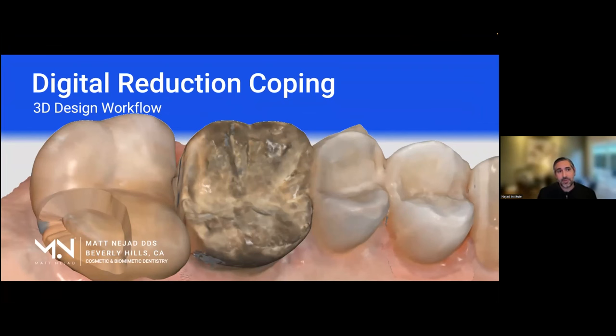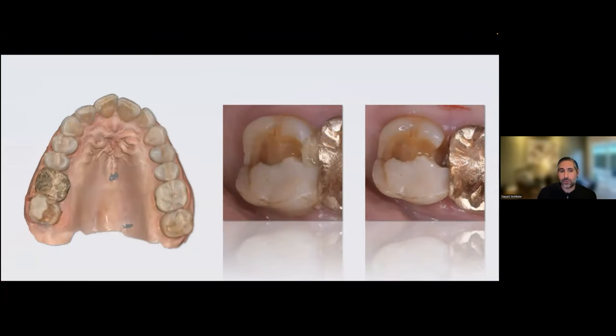Okay, so as we mentioned, we're going to be reviewing digital reduction coping 3D design workflow. I'm going to show you a real case that came up in my office and how I went about solving the problem and making the reduction jig with my experience in digital design, specifically getting familiar with Medit Design and all its different features.